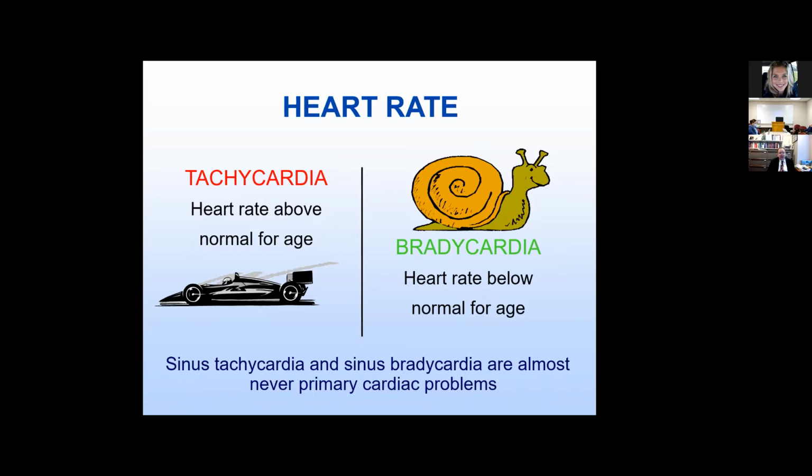Also realize that sinus tachycardia and sinus bradycardia are almost never primary cardiac problems. This is very, very rarely directly related to the heart. So say we have a newborn baby who's getting very bradycardic, and they call me. I say you should look for reflux, for apnea, for other things, because these are very rarely primary problems. And if they are, they tend not to be episodic. If you see rapid increases and rapid decreases in rate, that's more likely to have some pathologic mechanism. But in general, resting sinus tachycardia or sinus bradycardia are not issues.